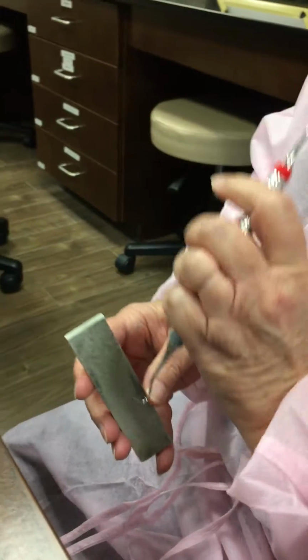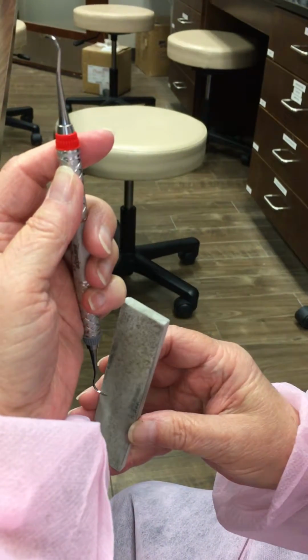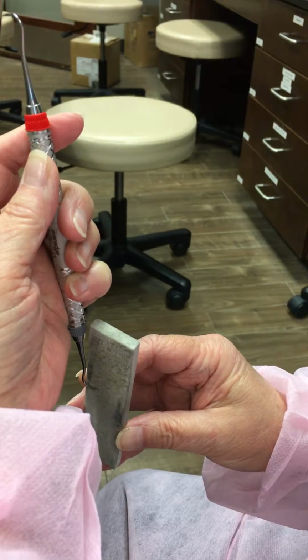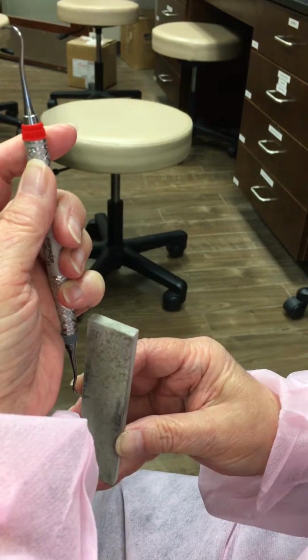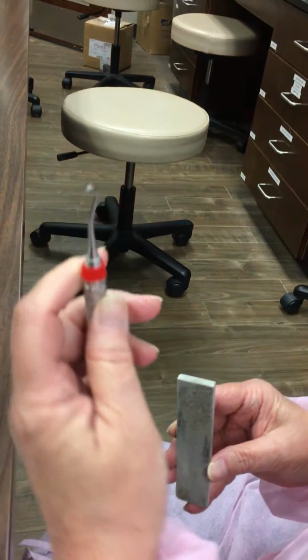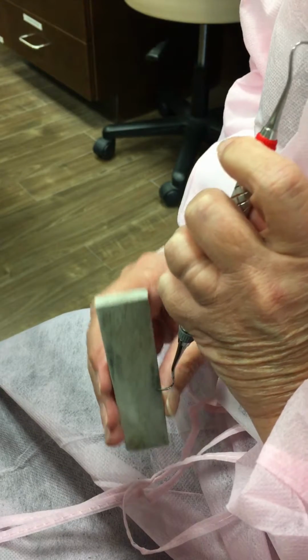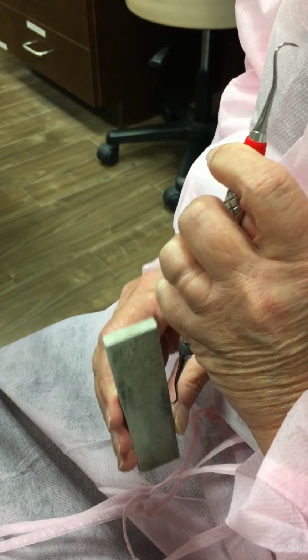It too is a double-bladed, double-ended, or paired-ended instrument. So the same thing, I'm going to start at the back end. Now I have my toe toward me. Close, open. Middle. Downstroke. I have sludge. So now I'm going to turn away and hold it down so I can look down over the instrument. And I'm keeping my fingers out of the way.